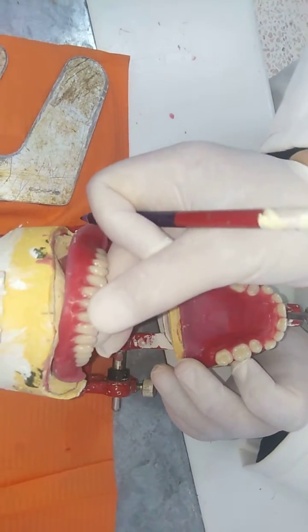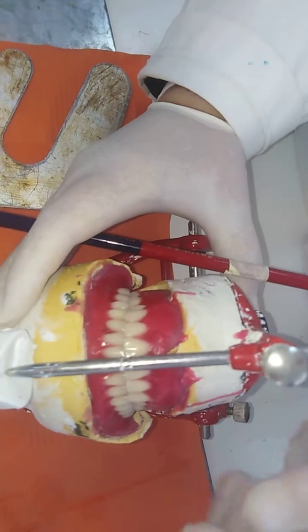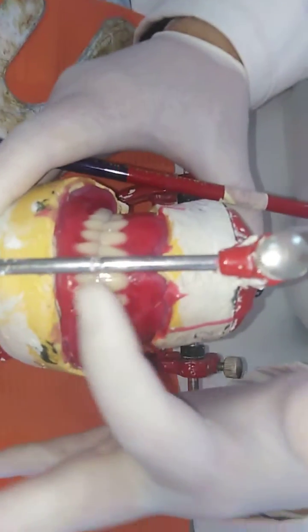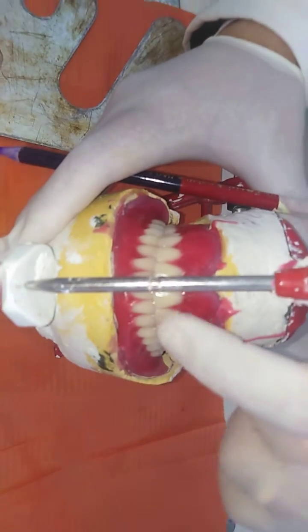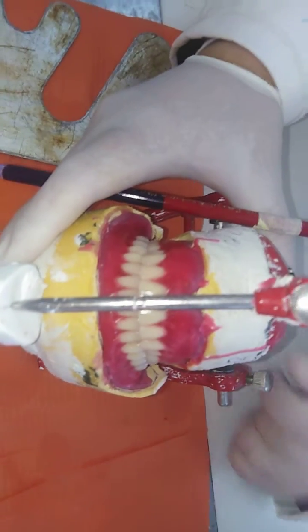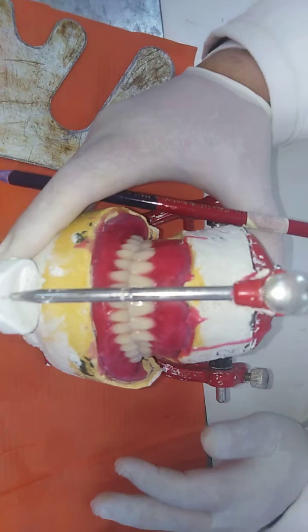The second modification is reversing the overjet. The reversing of the overjet, if there's mild class 3, we do a single or unilateral crossbite. But in this case, this is a bit more severe class 3. We were able to do the camouflage by the teeth, proclination of the upper, retroclination slightly of the lower, and we got the class 1 relation in overjet and overbite. This will aid us in having the S sound perfectly.